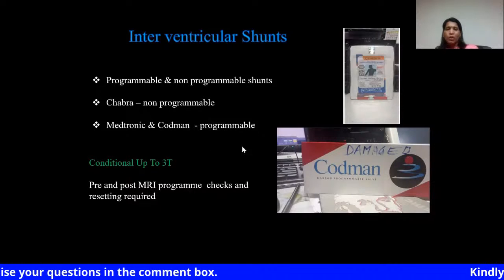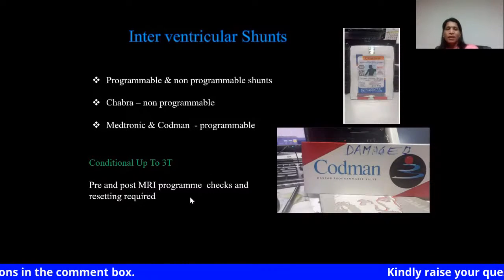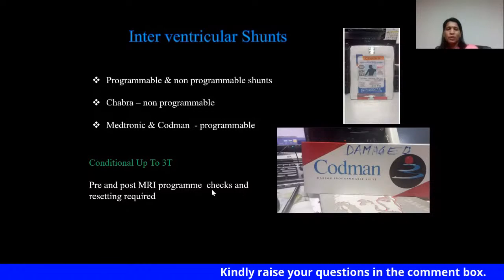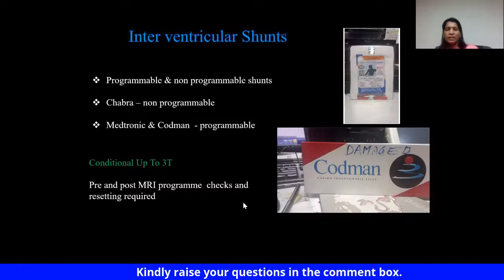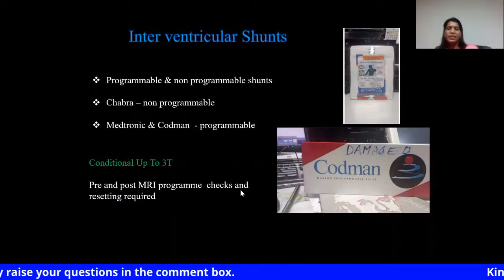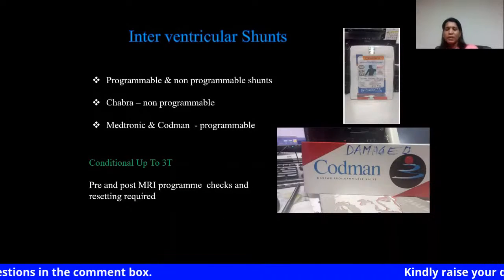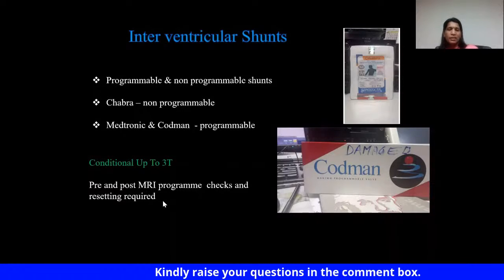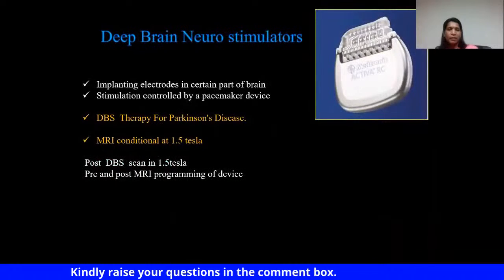But the programmable ones need a program check before and after the MRI procedure. If the program is changed, it has to be reset. So a neurosurgery consultation will be required for such patients after MRI.